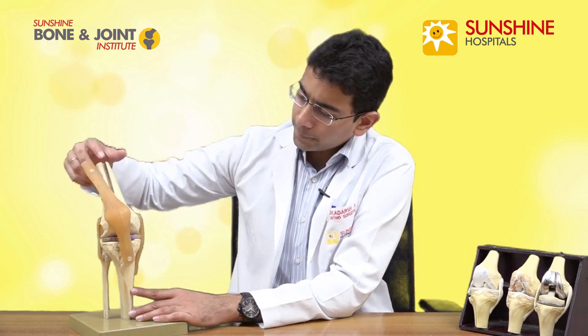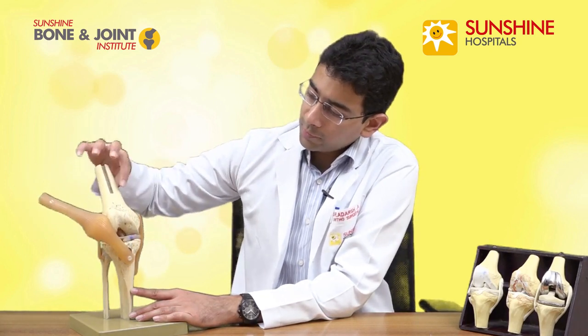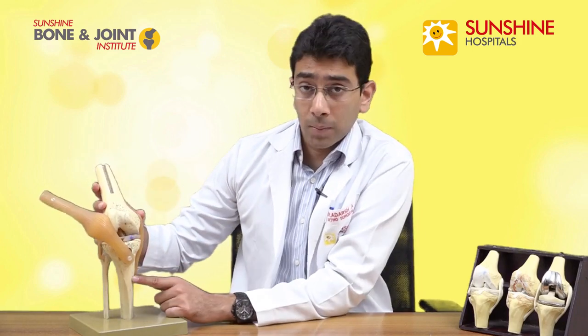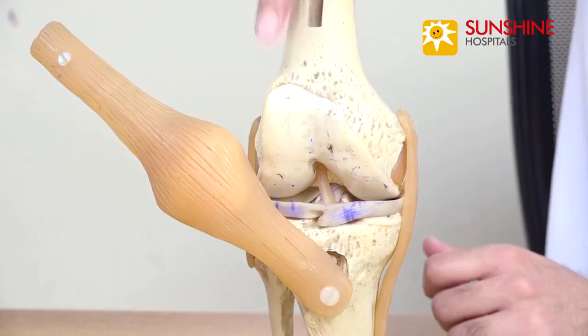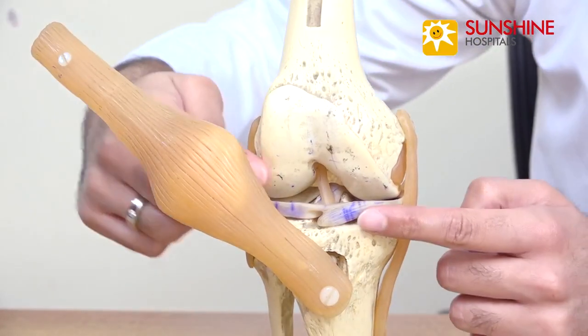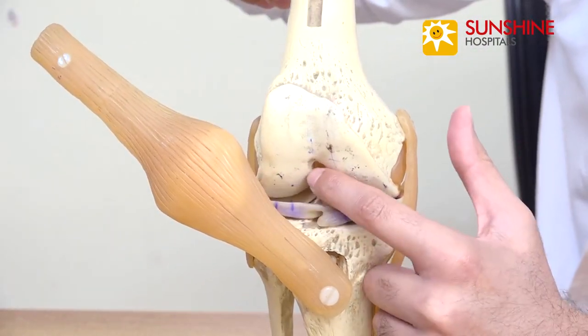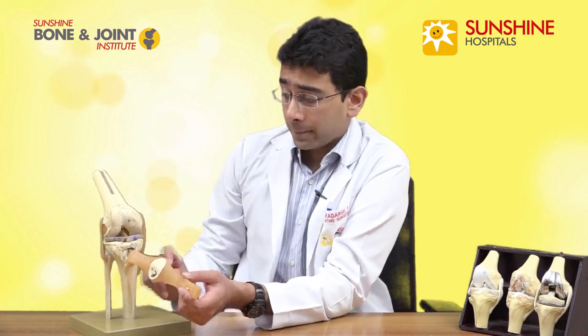This is the model of the knee joint. If I move away this tendon over here — this is the femur bone on the top, this is the tibia bone. In between we have different components of the joint. This shiny smooth area is known as the cartilage, and these rubbery areas which you see here are the menisci, and in between you have the ligaments, and in the front of the knee joint you have the kneecap.